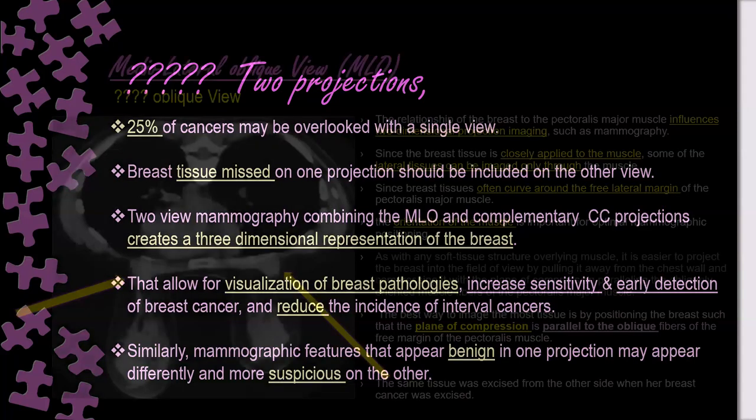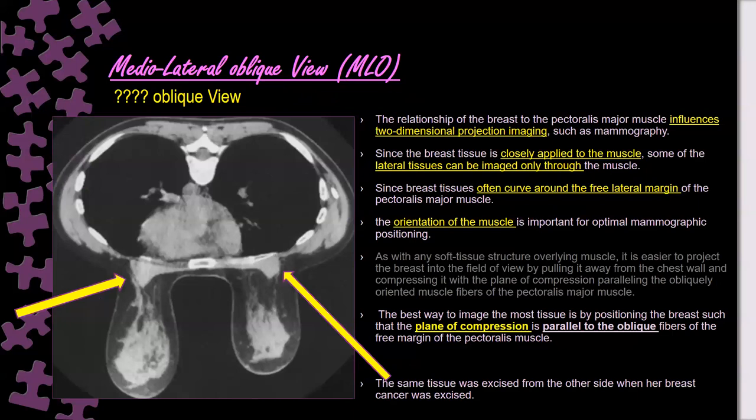Okay, so why the oblique view, the mediolateral oblique view? Why are they doing it mediolateral oblique? Why is it not the reverse? Why is it not a lateral view? Why are they making it oblique and in that direction?